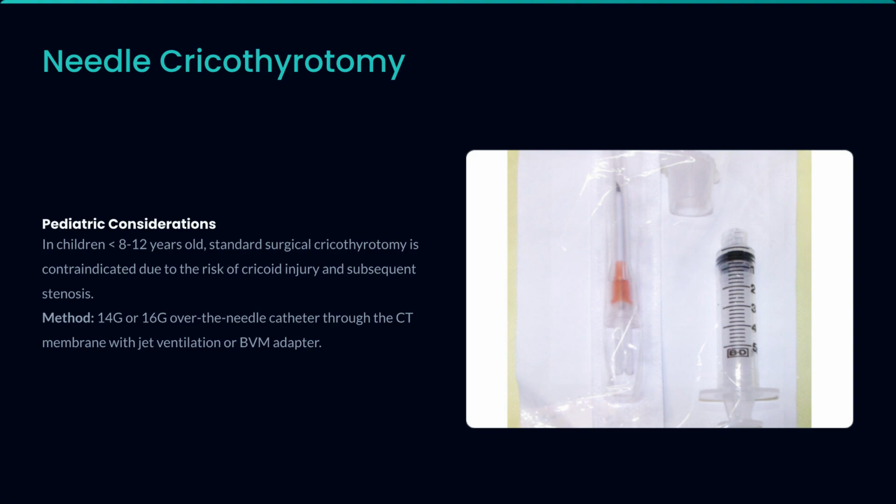For pediatric considerations, in children under 8 to 12 years old, standard surgical cricothyrotomy is contraindicated. The alternative is needle cricothyrotomy using a 14G or 16G catheter and jet ventilation.